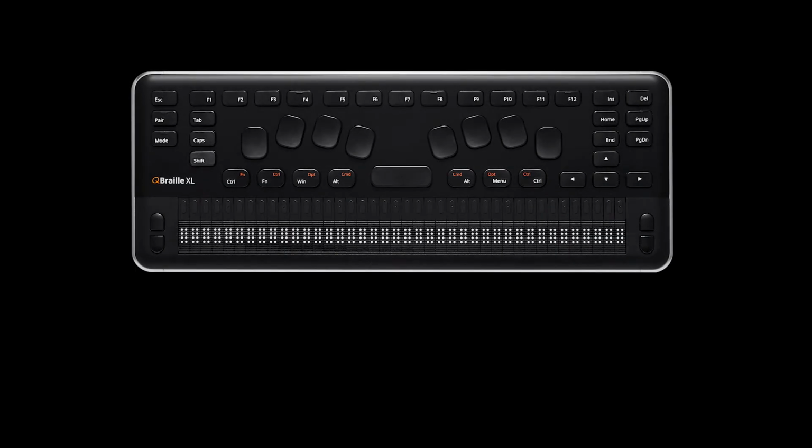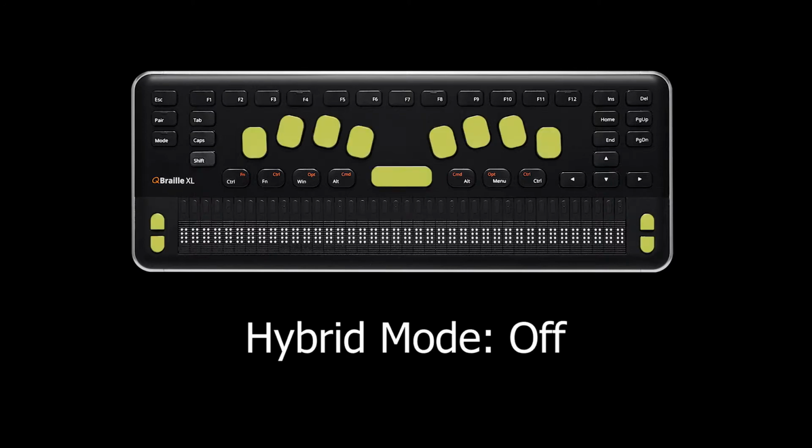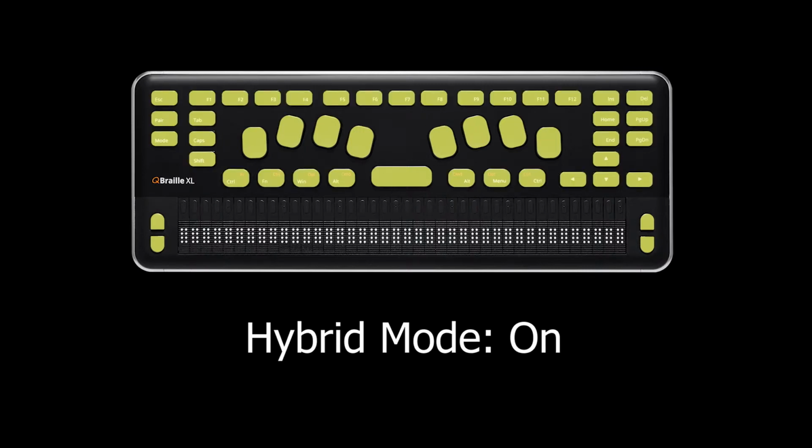The QBraille XL has two separate modes, hybrid mode on and hybrid mode off. When hybrid mode is off, the QBraille acts the same as any other Braille display. You will use the Perkins keyboard for navigation, commands, typing, and other things. When hybrid mode is turned on, the QBraille will act as a QWERTY keyboard. This means that navigation will be handled with the arrow keys and tab, and you can use the common keyboard commands directly from the QBraille.